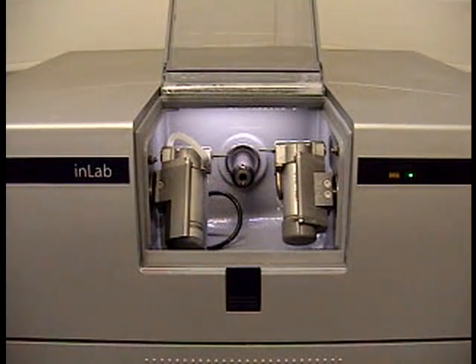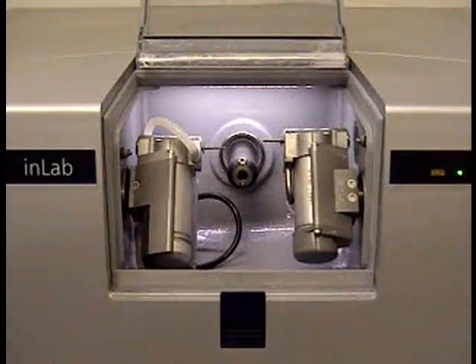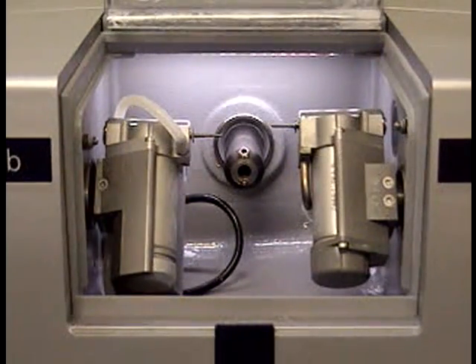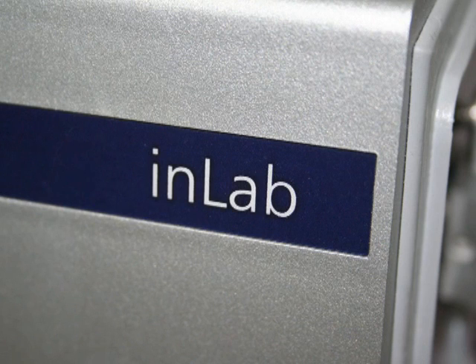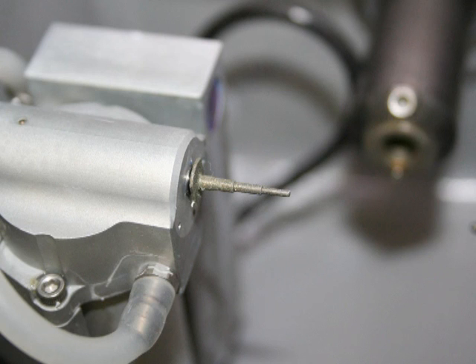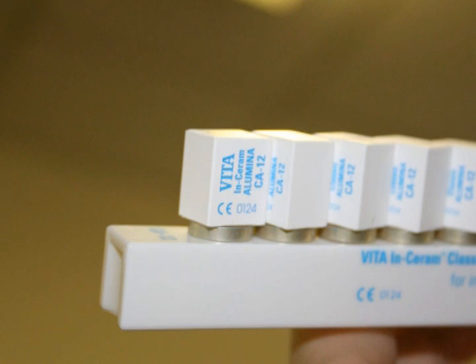This is the milling unit. As we zoom into the little milling chamber — only about 15cm across — you can see the two milling heads and the central arm that moves in and out holding the block. This is the in-lab unit, which has an extended milling arm on one side for larger blocks so we can do multiple units. On the right-hand side we have a cone-shaped burr, and on the left-hand side a step burr — both diamond burrs.